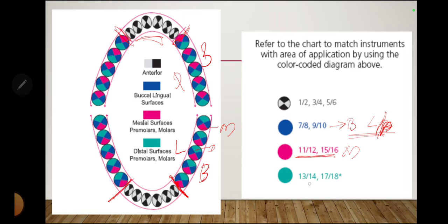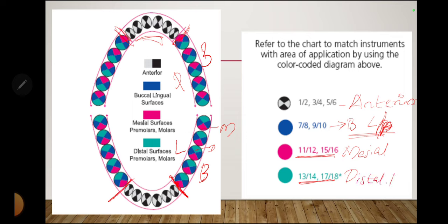To summarize: 1-2 to 5-6 are for anteriors; 7-8 and 9-10 are for the buccal, lingual, or palatal surface of posteriors; 11-12 and 15-16 are for the mesial surface of posteriors; and 13-14 and 17-18 are for the distal surface of posteriors. This can be asked in exam questions regarding which Gracey curet to use for a specific tooth surface or area of the mouth.